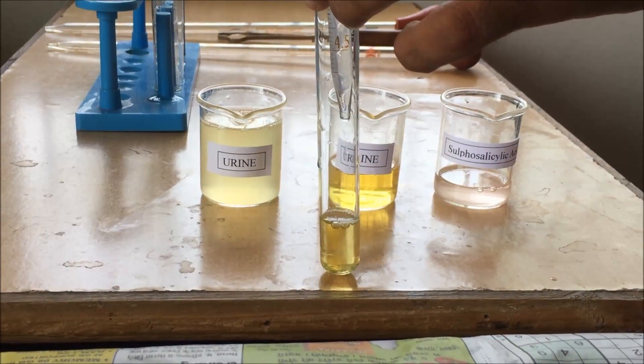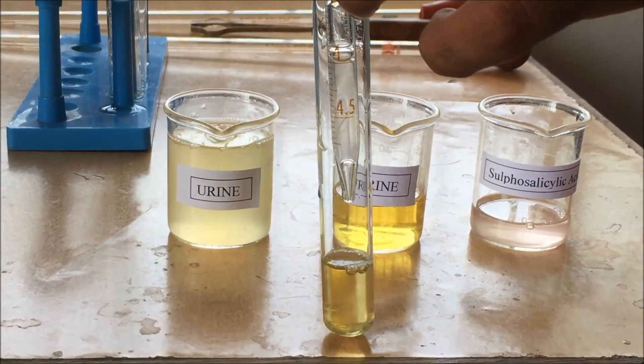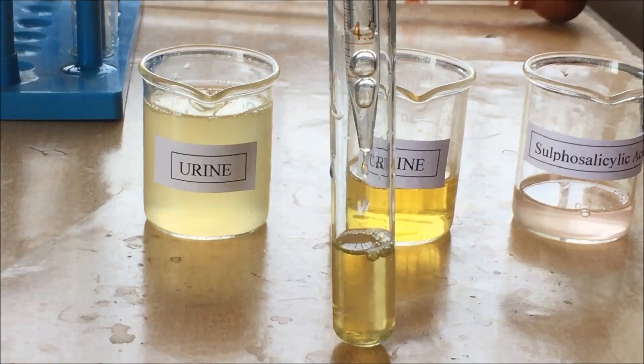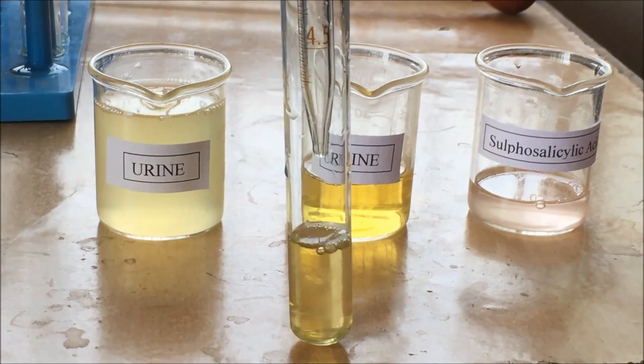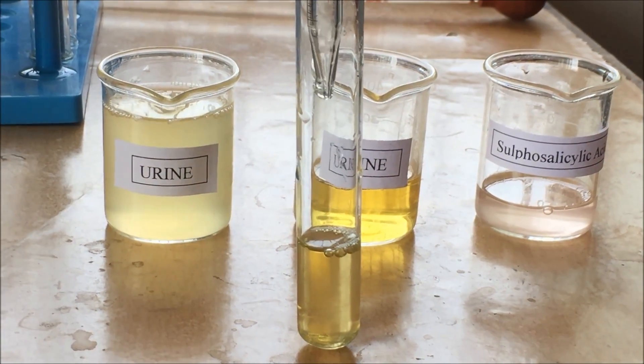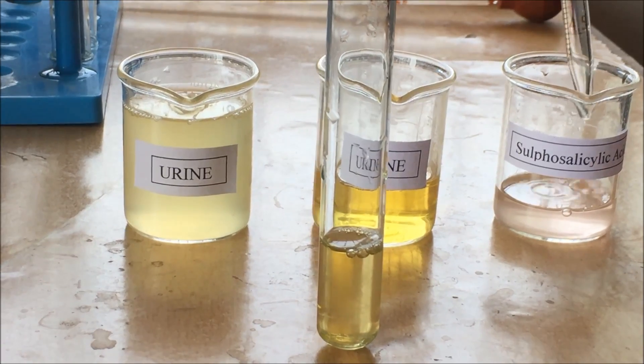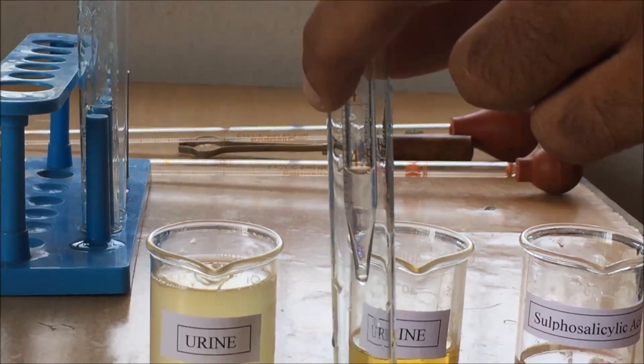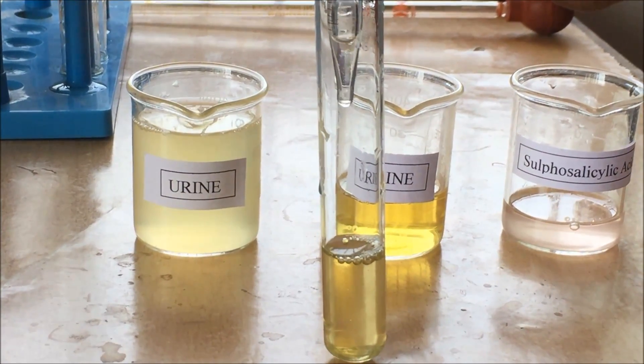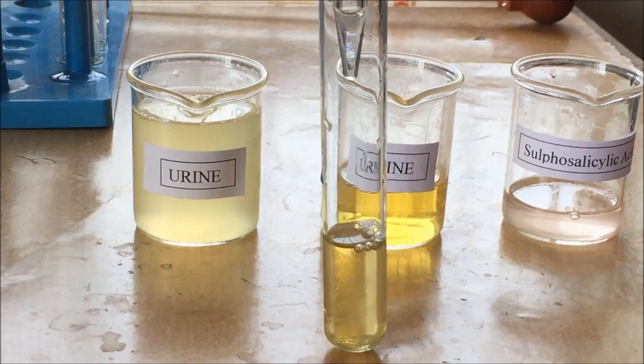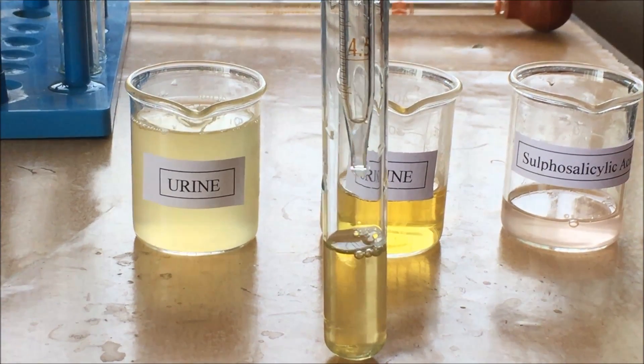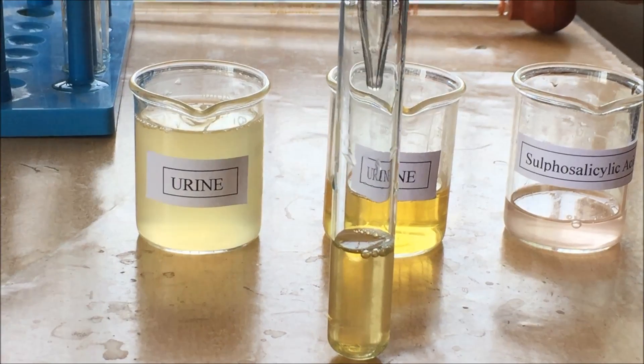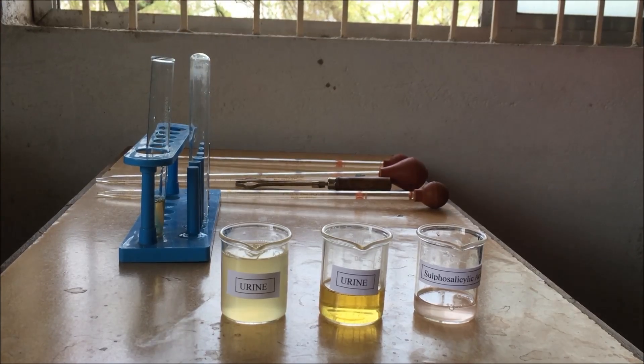We are now adding sulfosalicylic acid drop by drop over the urine solution. If there is albumin in the urine sample, sulfosalicylic acid will denature the protein and form white cloudiness or turbidity, indicating the presence of albumin. But we are not getting any white precipitate or cloudiness here, so it indicates a negative result.